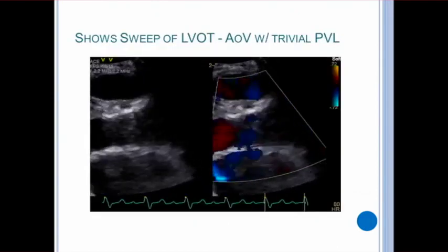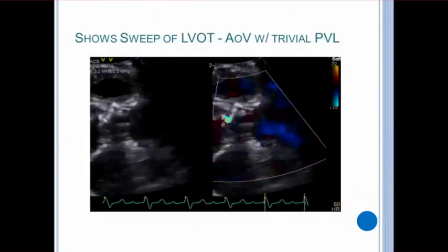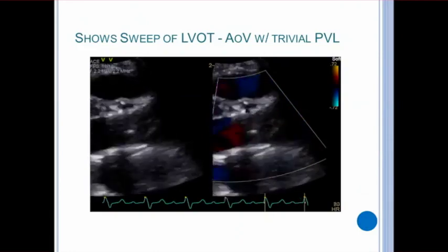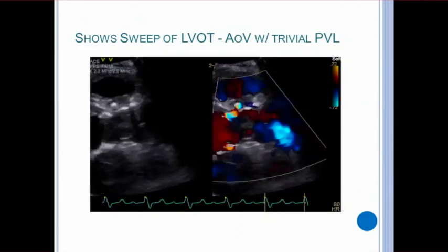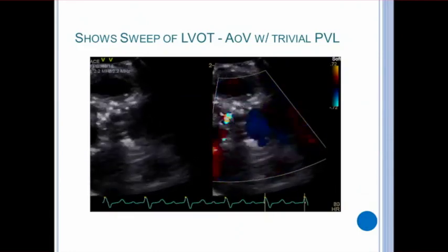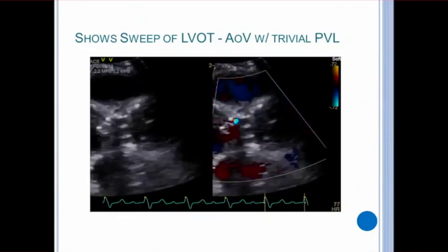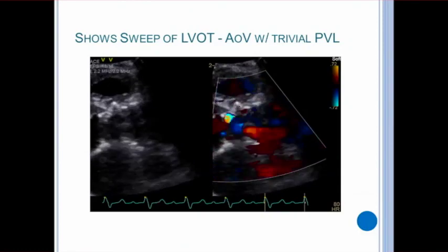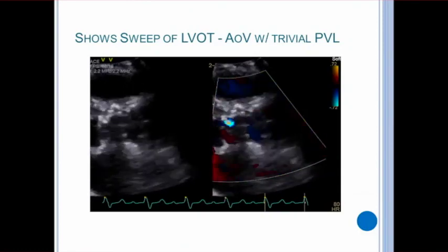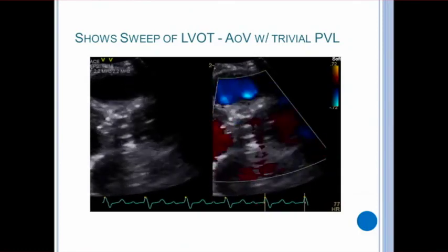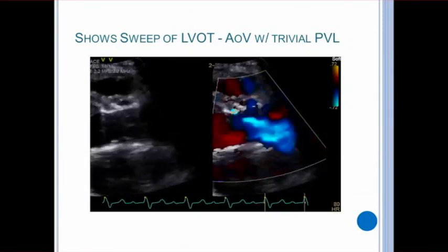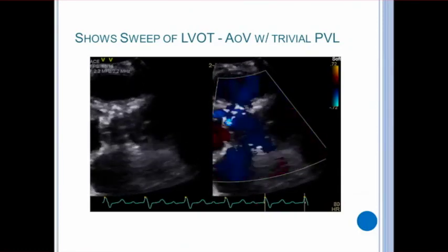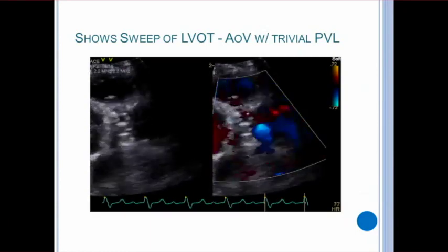Here is an example of sweeping through the aortic valve in the parasternal long axis. The transducer sweeps from a lateral angle to a medial angle, making sure to go across the entire aortic valve. By performing the sweep, you can start to appreciate the paravalvular leak anterior to the valve.